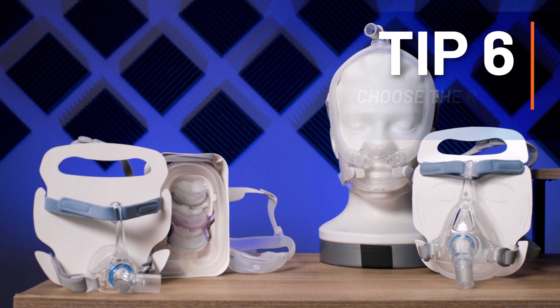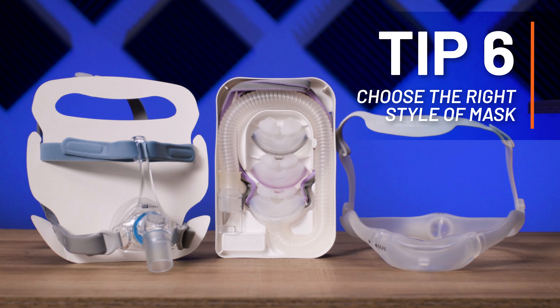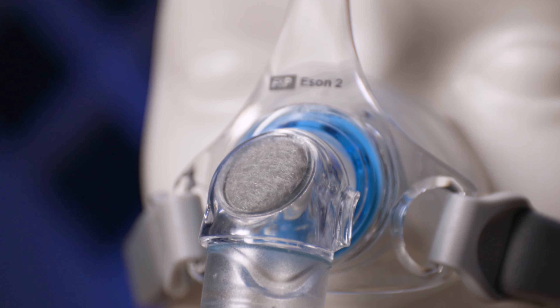Tip six is to make sure you have the right type of mask for you. There are many different styles of masks and each style has its benefits and drawbacks. For example, if you tend to sleep on your back and you're using a full face mask like this one, oftentimes the lower jaw can relax when you fall asleep and this can break the seal. In that case, switching to a nasal mask would prevent this.